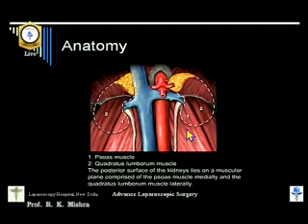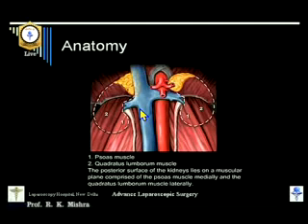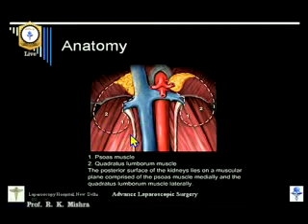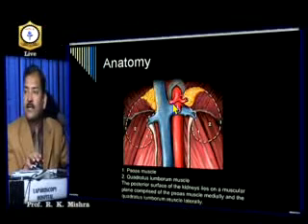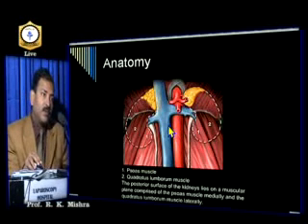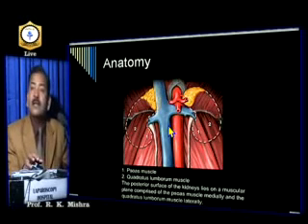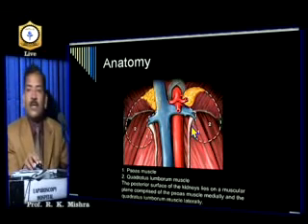These two muscles give the bed for the kidney to rest upon. Whenever you enter by the retroperitoneoscopic approach, the first thing you have to find is the ureter, which always lies over the psoas muscle. Medially it will be formed, and just after the ureter you will have the peritoneum, which is the boundary between the retroperitoneum and the intra-abdominal organs. Take care that the peritoneum should not be accidentally breached. The vena cava and aorta have different relations on each side: on the left, the aorta is nearer; on the right, the vena cava is nearer. Many surgeons consider left nephrectomy easier than right, and this holds true for the laparoscopic approach as well.